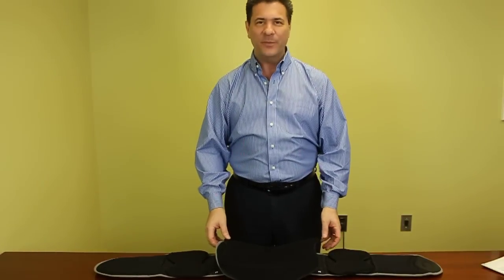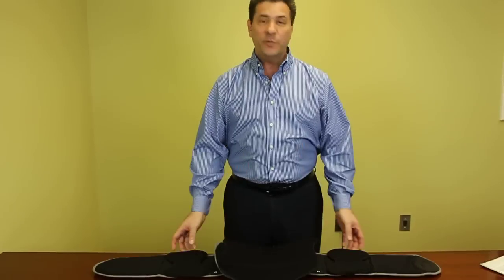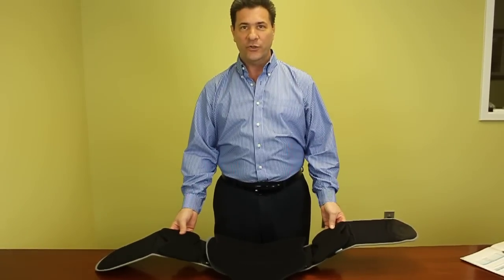Hi, I'm Andy and I'm here to help demonstrate the Comfortland Discovery 10 back brace. This back brace has the PDAC code of L0637.